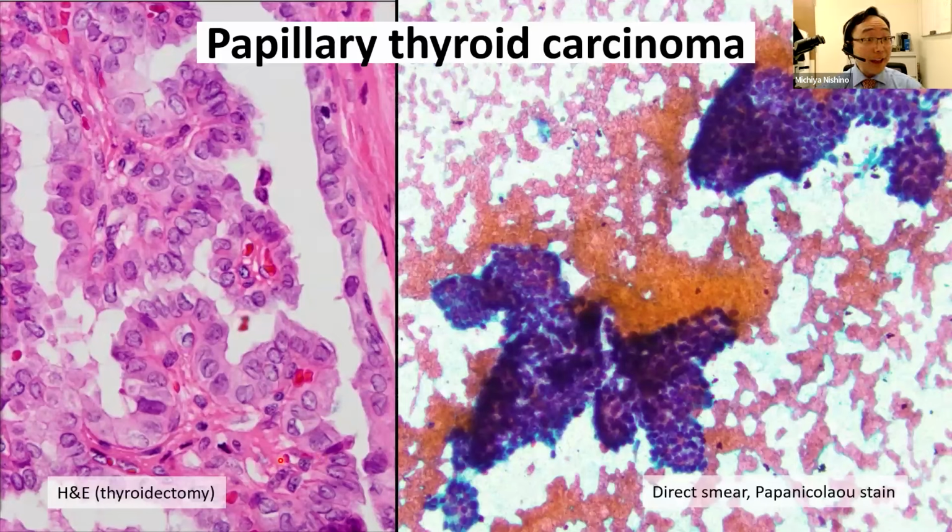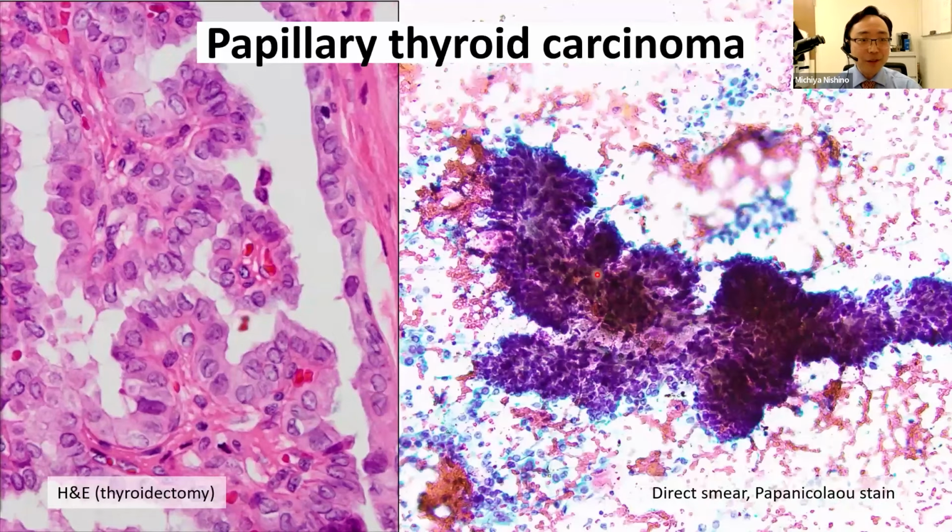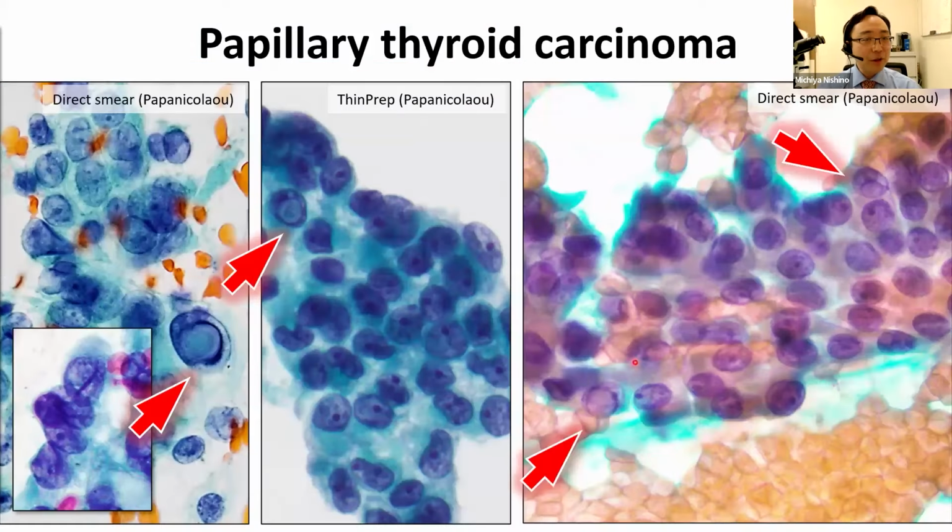When we FNA a papillary carcinoma, the aspirate shows numerous cells arranged in crowded sheets or papillary fragments with branching arms like these. And on higher magnification, there's nuclear enlargement and overlap. There's nuclear contour irregularity with longitudinal grooves and intranuclear pseudo-inclusions, and chromatin pallor as well.